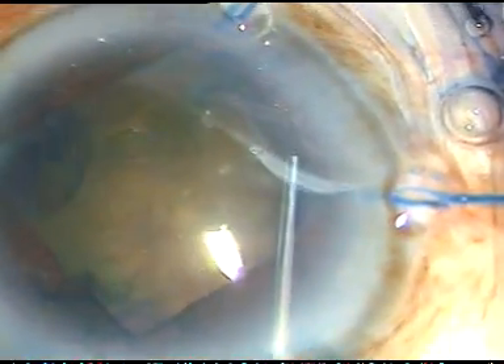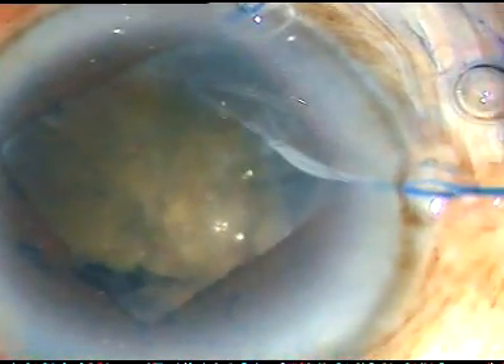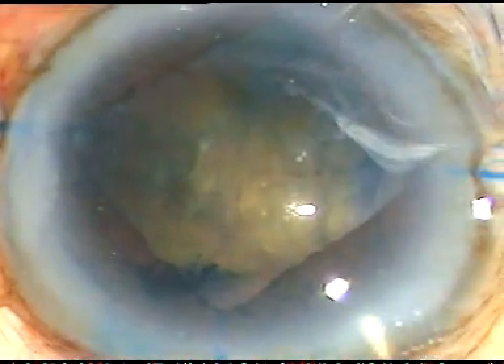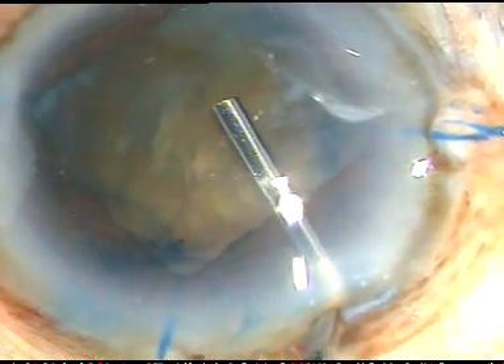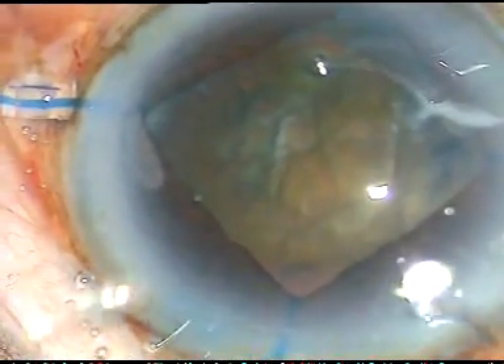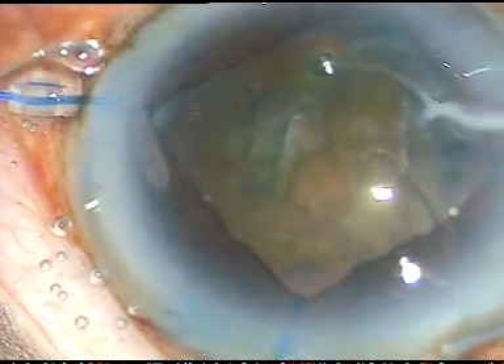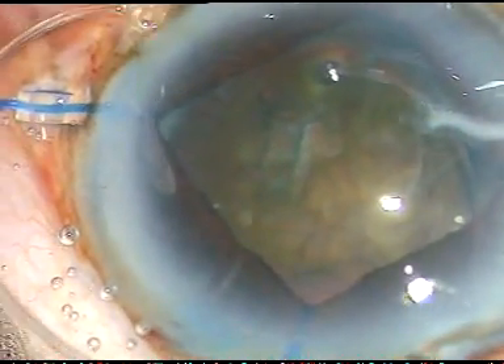Now I am doing a little bit of hydrodissection. I do hydrodissection but I don't rotate the nucleus, because rotation of the nucleus may cause more stress on the zonule and more zonular fibers may get torn. Now I am applying the CTR — capsular tension ring.